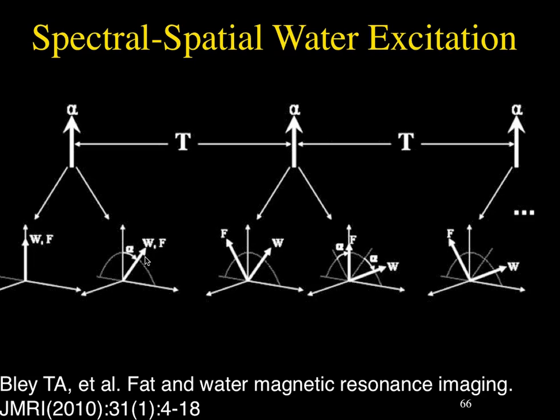This you just give two small pulses at the same angle timed just right so that you end up only exciting water. Is there any sequence that we look at on a daily basis that utilizes this, or is it a little fancier? Not really. I don't think this is used much right now. There's a type of this that we'll talk about in a minute, IDEAL, which is kind of like this, but much more sophisticated.